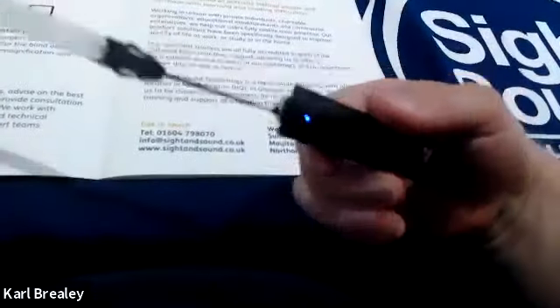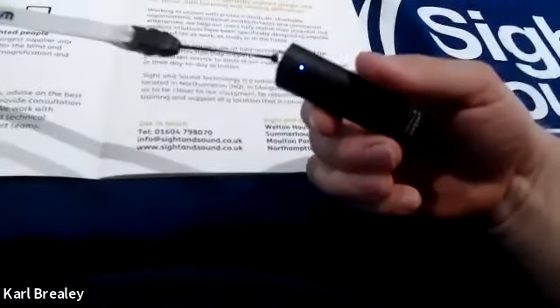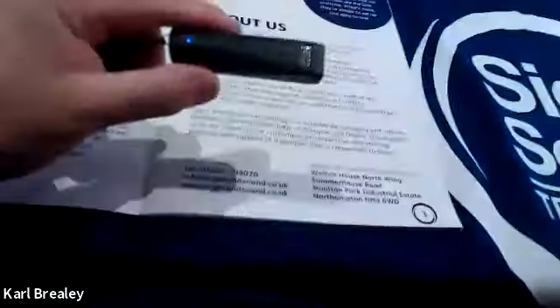So that's that. There is also a lanyard that comes with it. It is very advisable to get this lanyard attached and used. Obviously, with the device being so small now, it is a very easy thing to put down and lose. And obviously with the cost of them, you don't want to be losing something like this. Or maybe for our benefit, it's good if you lose them because you have to buy another one. For your benefit, not so good on the old bank balance.